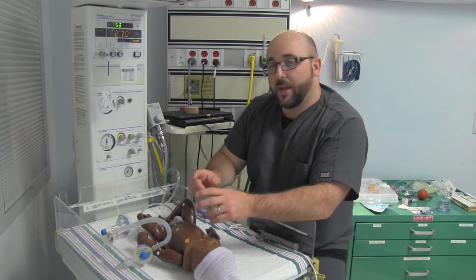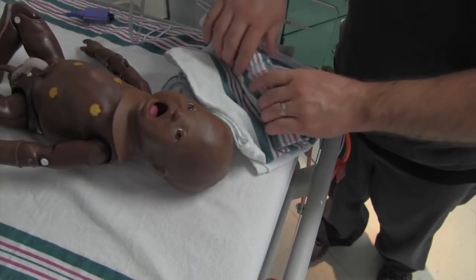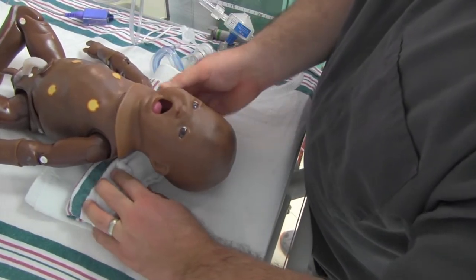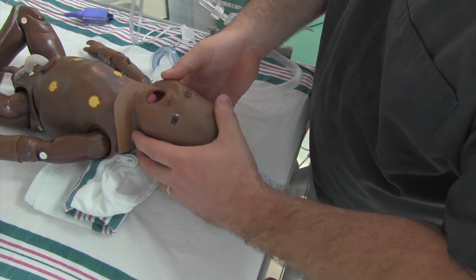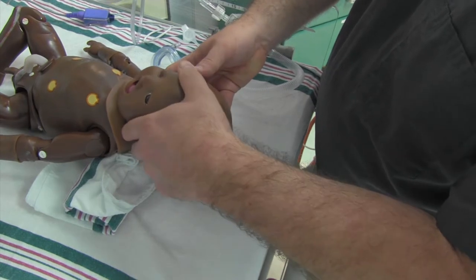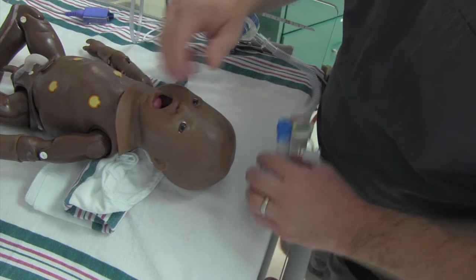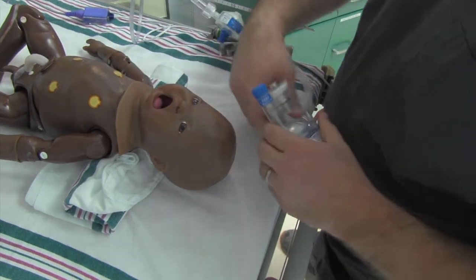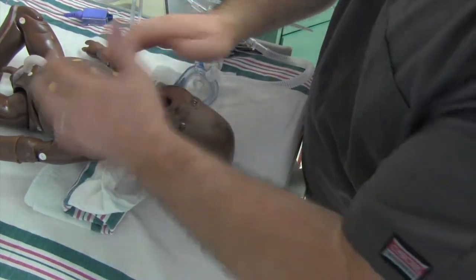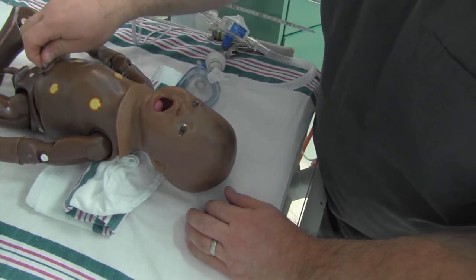Let me show you a little bit about sealing this mask on and then show a little bit with intubation. A nice aspect is a little bit of a towel roll - to get this kid in more of a sniffing position, more of a level position, so his airway is going to be most open for positive pressure ventilation. Initially when the child comes over: warm, dry, stimulate. Of course we're going to suction at the perineum, but we warm, dry, stimulate, check for a heart rate, look for respirations.